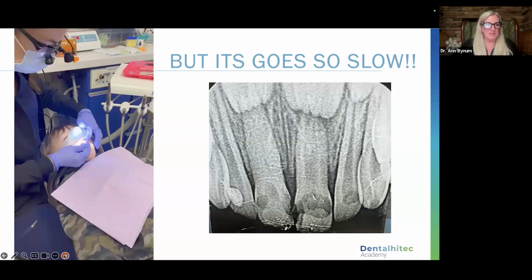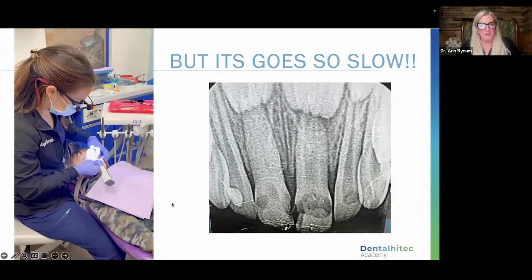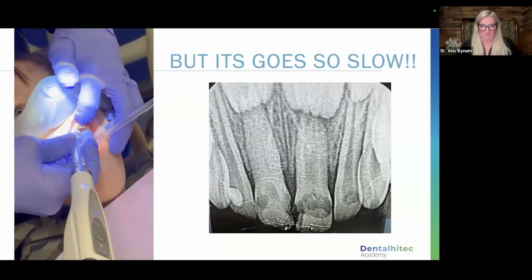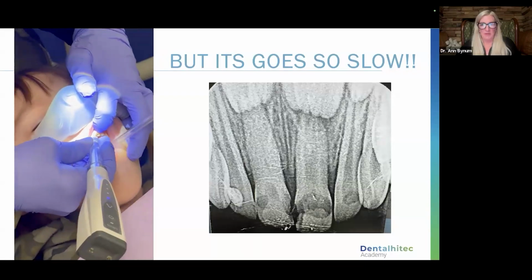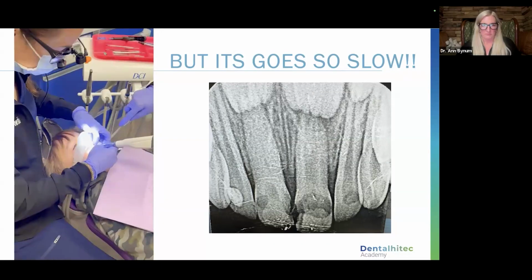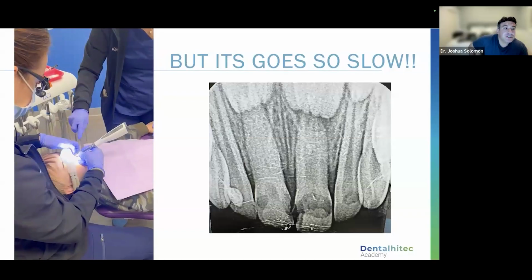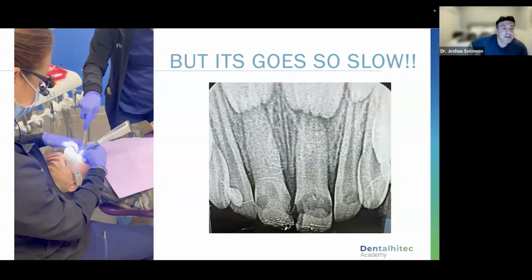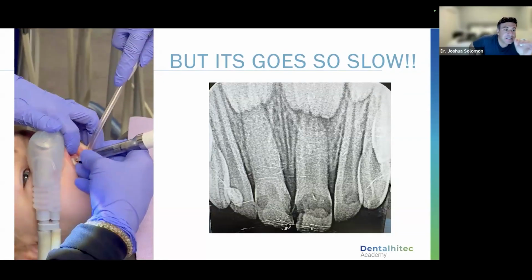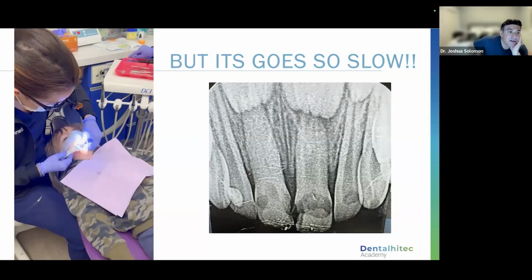So here is an example. This is Dr. Megan in our practice. I've got this sped up for you, but you're going to watch an entire treatment. She's giving stage 1. Again, super important to be looking at your x-rays where you have bones. So she's going a little superior to the apex there. Can you see how good her positioning is here? She has a fulcrum. In a lot of the videos we showed earlier, we're holding the device farther away so you can see, but this is perfect, 100% fulcruming and keeping that patient safe and in line.